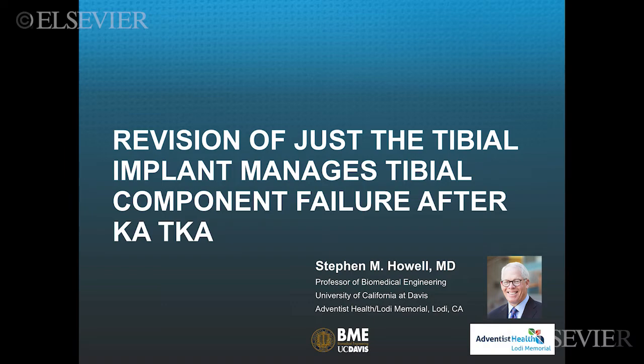Now, if you're stuck with a failure of a tibial component after kinematically aligned total knee arthroplasty, you can perform a revision, and this little section talks about revising just the tibial implant. That is usually all you have to do to manage tibial component failure after calipered kinematically aligned total knee arthroplasty.